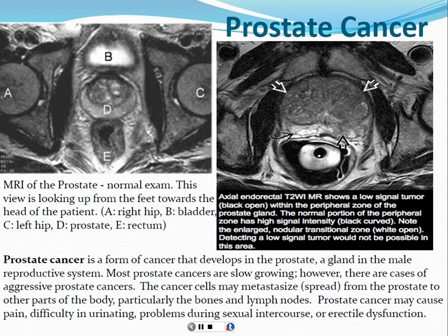But in certain cases, they have a way of scoring all these factors, and if a patient's in the gray zone where they're not sure if they should treat him with radiation versus doing surgery, then MRI can really help sort out whether this tumor has spread outside the gland or not. Typically the patients who come for this study already have a known diagnosis of prostate cancer based on biopsies that a urologist would take.